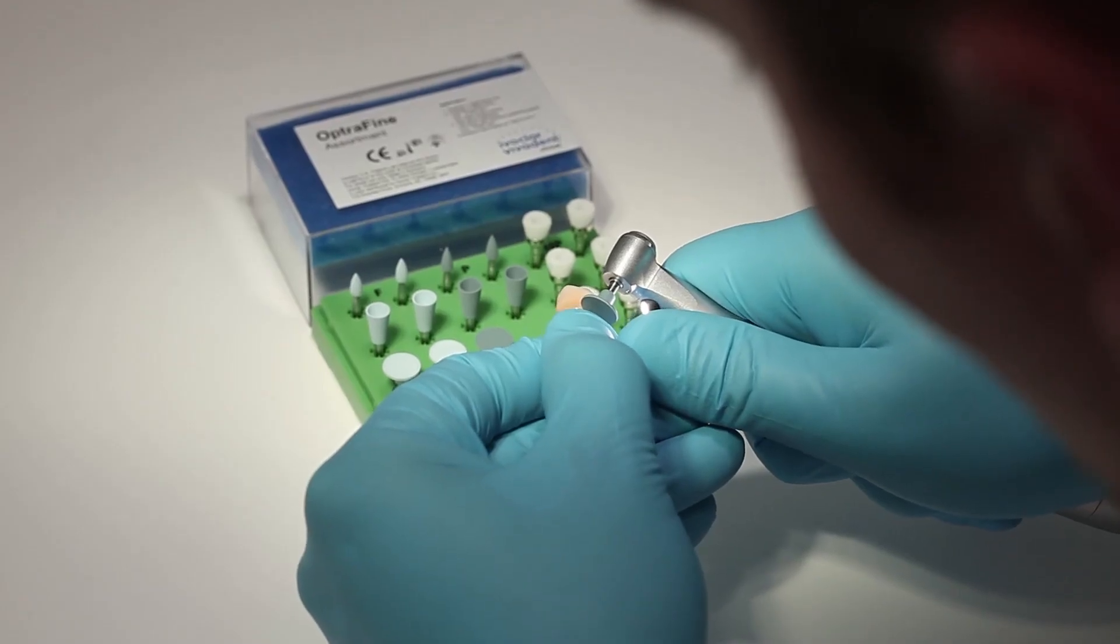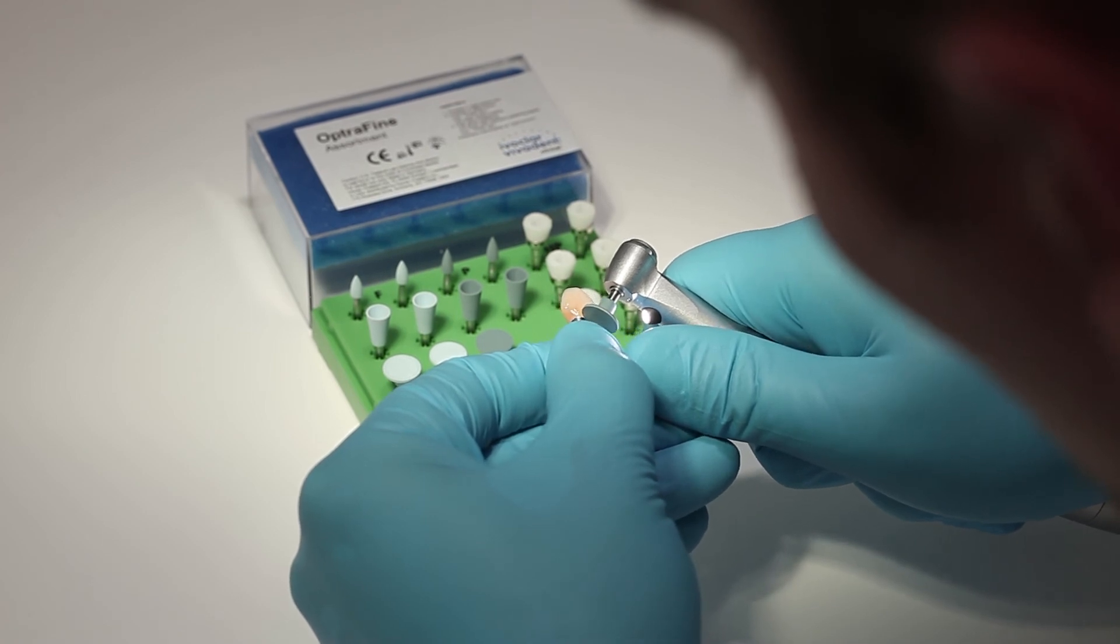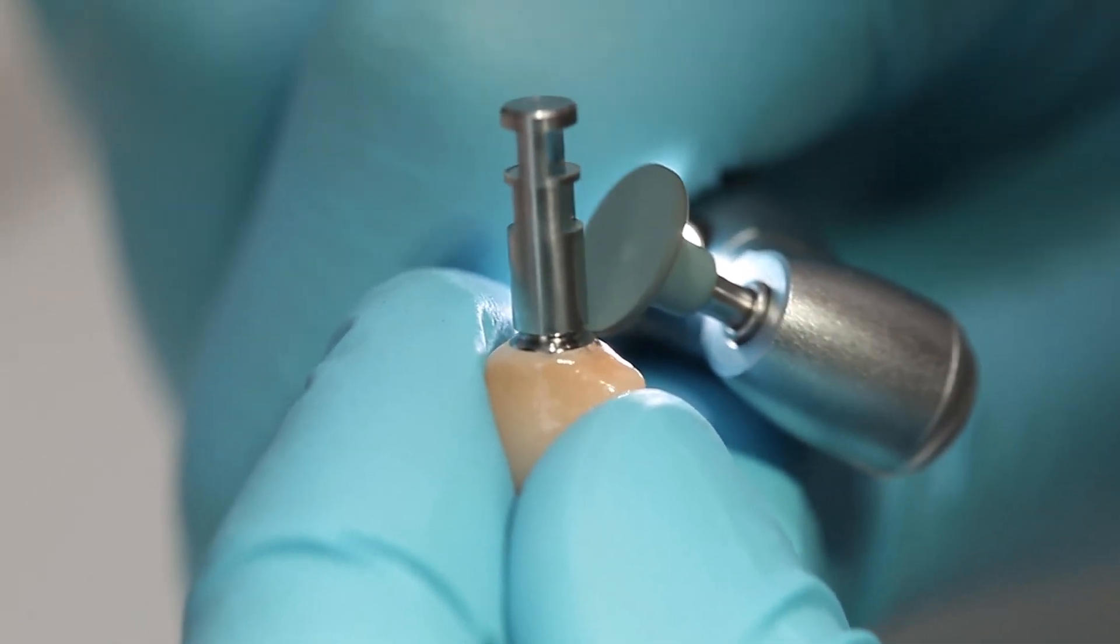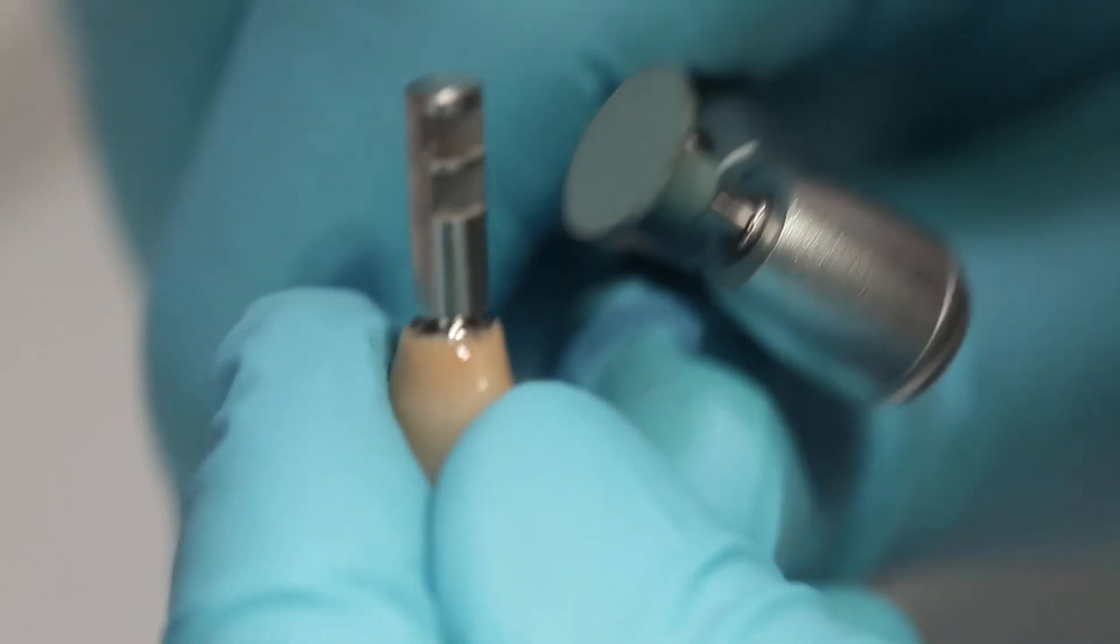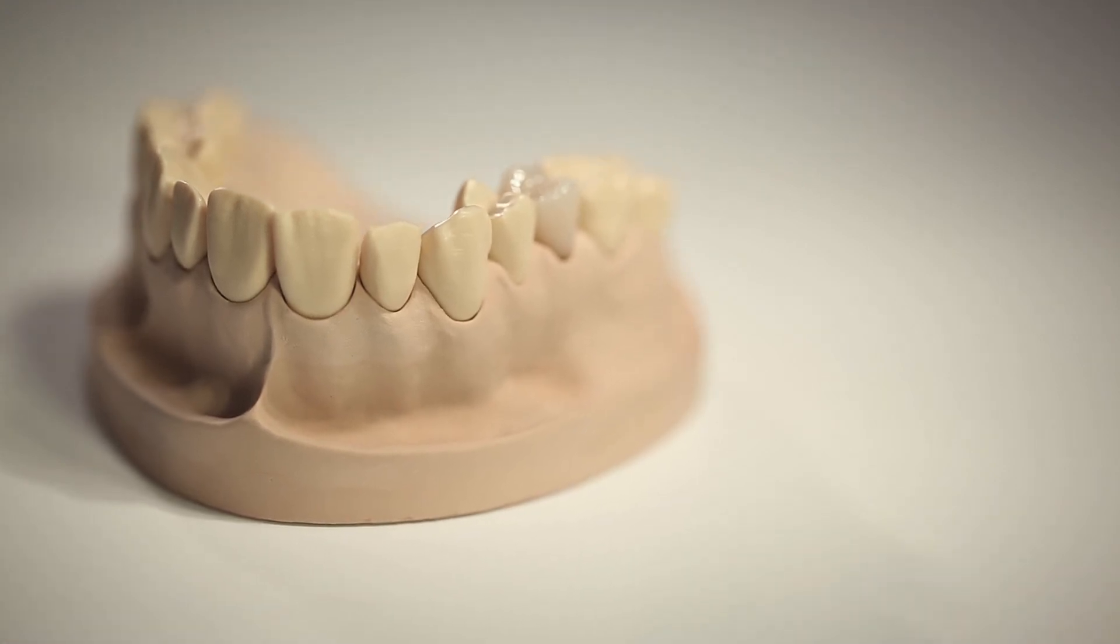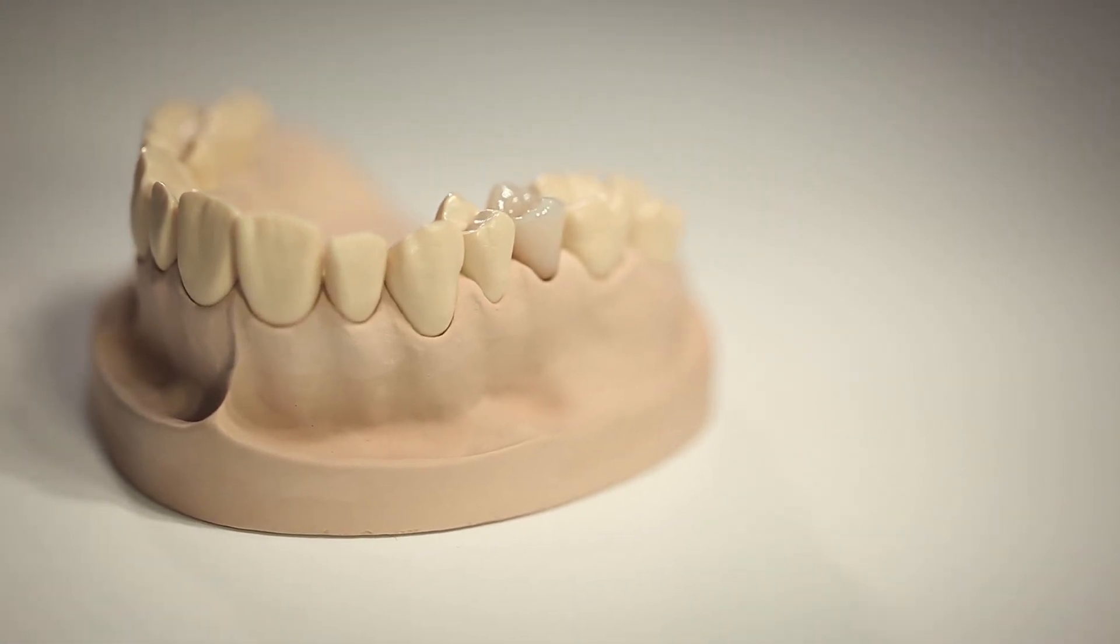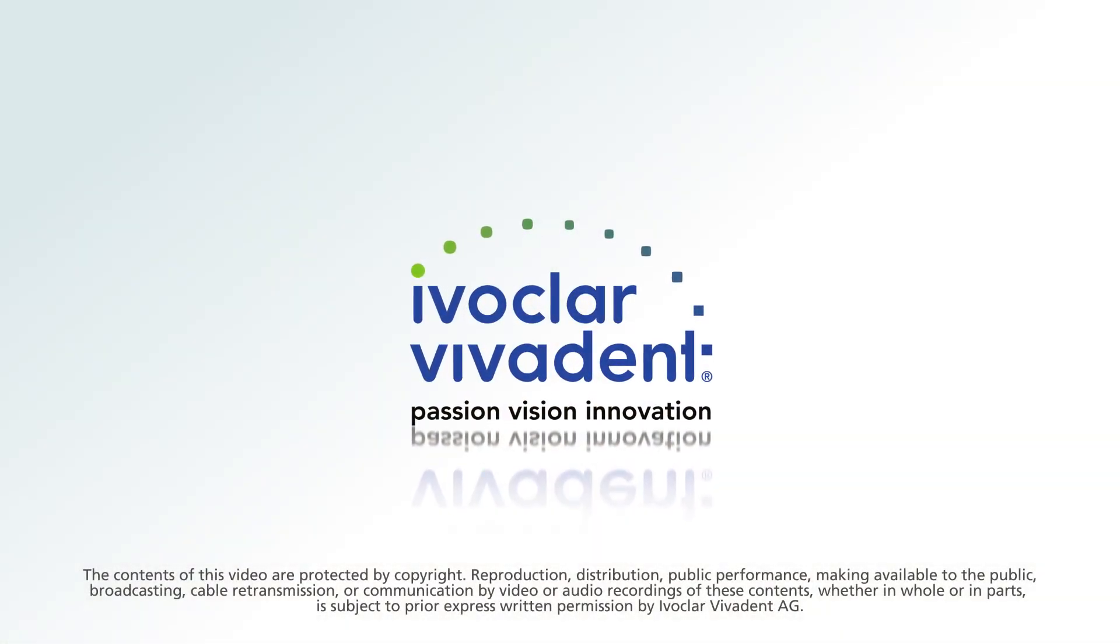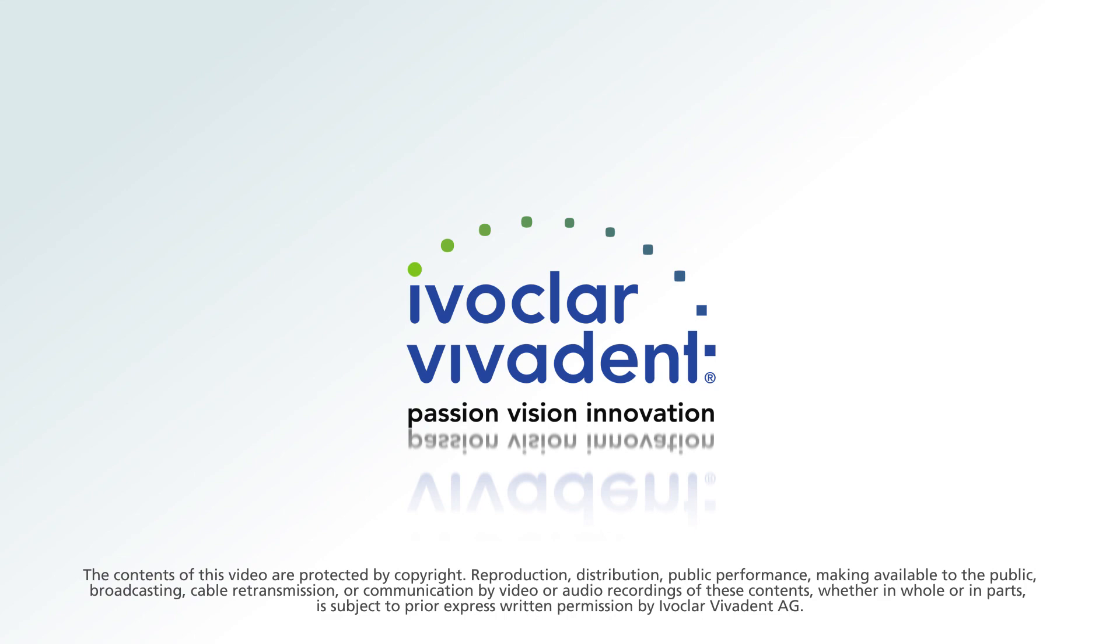Carefully polish the cement joint using rubber polishers, for instance Optrafine, at a low speed of no more than 5000 revolutions per minute to prevent overheating.